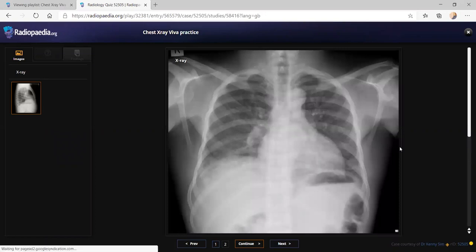Okay. So this patient is a 20-year-old coming with acute chest pain and fever. This is a frontal chest radiograph of a skeletally mature patient. What I can see, first of all, is that there is cardiomegaly. There is a left-sided paravertebral lobulated lesion.